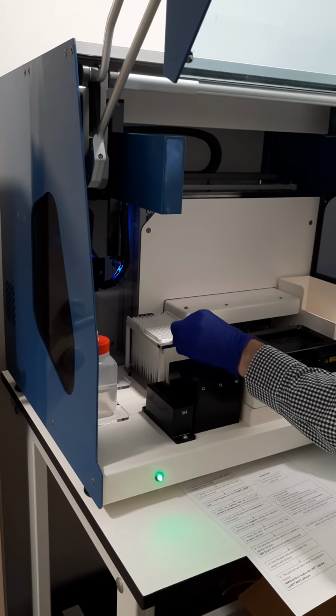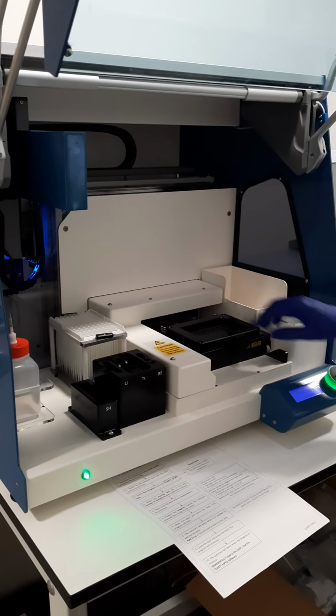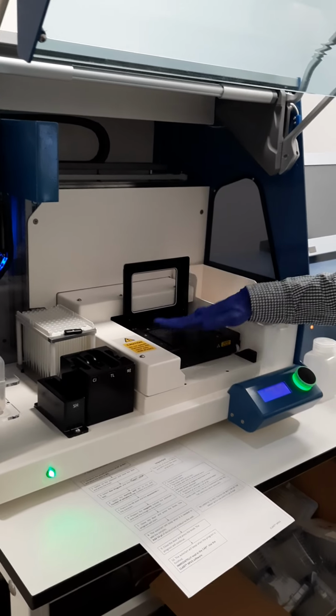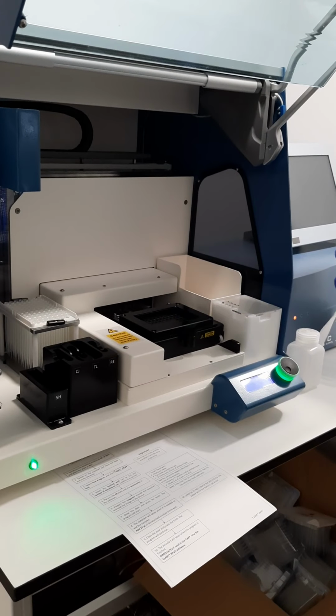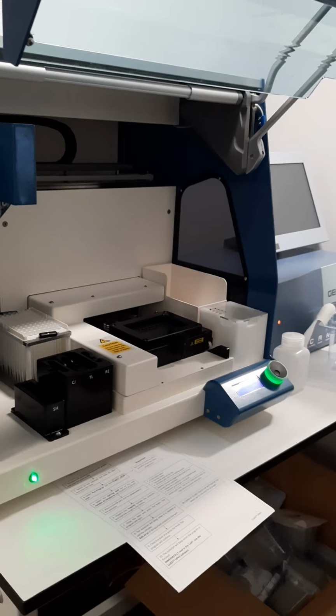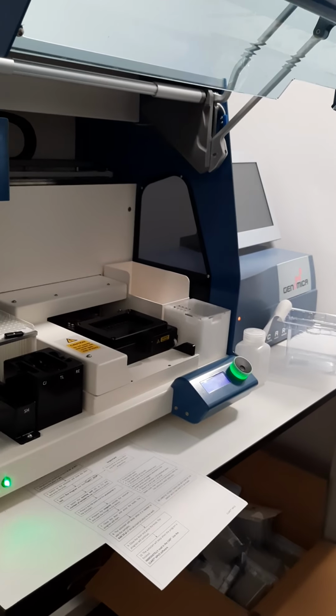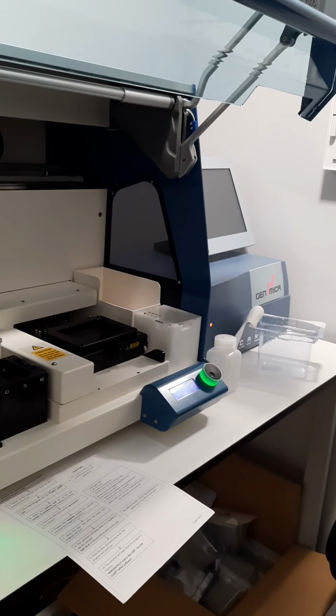And we close this. There. Okay. Then we load the microplate. Okay, here with the arrays. I have brought one from our technical service that is used for calibration and all these things. It's just for the OQ because it's going to add just water, okay?